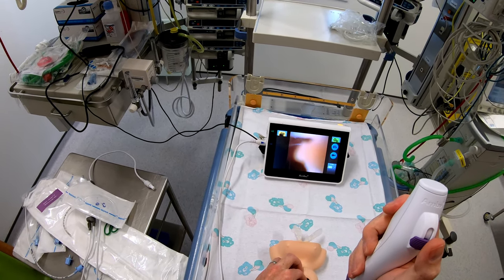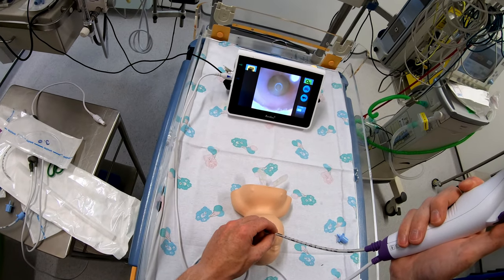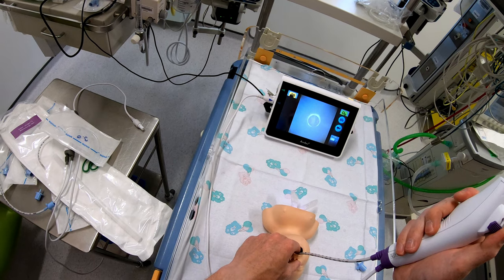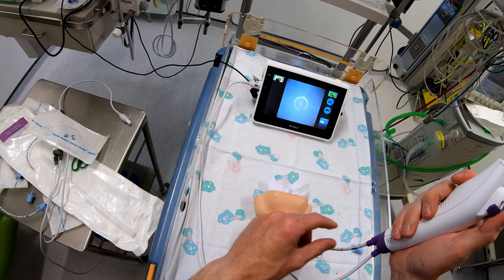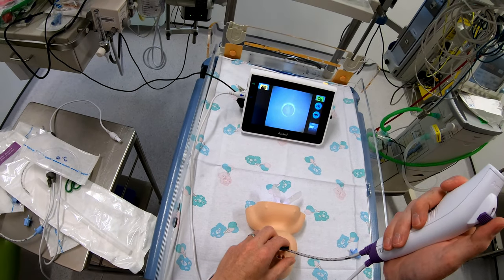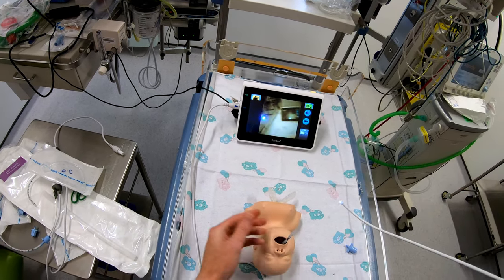As I'm getting down towards the carina, one of the things I'm noticing is that I'm running out of space in the mouth. Although I'll have to check whether the distances here match a real patient, as I get to carina level I'm already manipulating the scope from inside my mouth because the tube is too long to allow proper manipulation. So although diameter-wise this might be okay, it might just be a little short. I can still pass the tube over the top — tube just above carina — and then withdraw the scope.